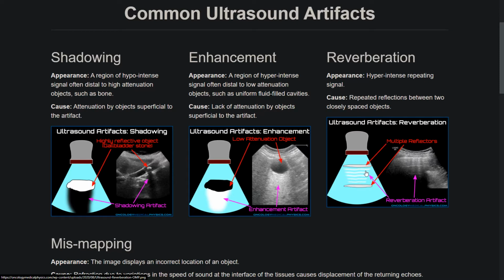To avoid such an artifact, the user should move the transducer and beam to various angles to avoid reverberation and to see the area that was covered by the artifact.